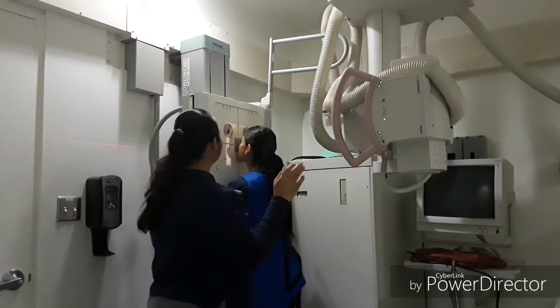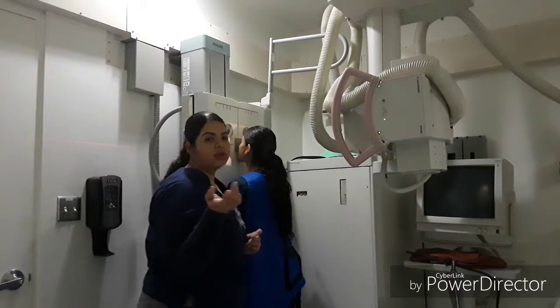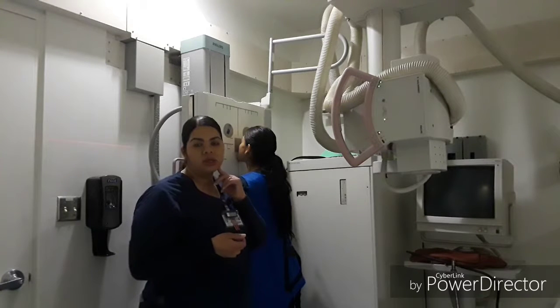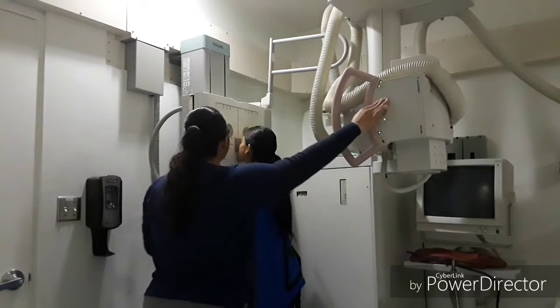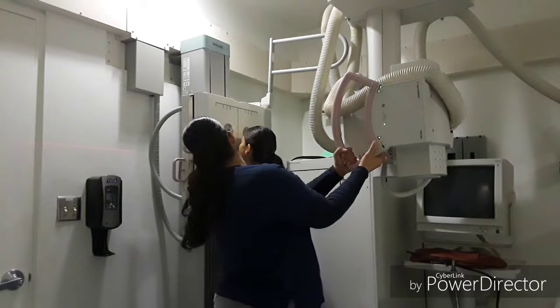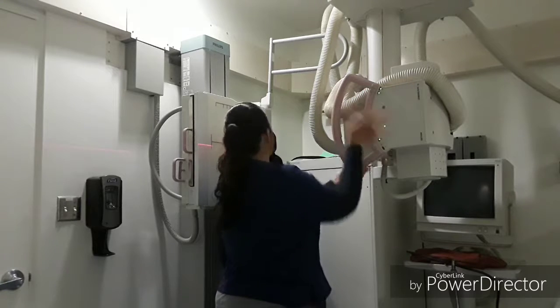Okay, should be good right there. Her OML is approximately 37 degrees with the IR. Her MML is perpendicular to the IR, and so should the midsagittal plane. Central ray should be exiting approximately at the acanthion. I'm going to collimate in a little.